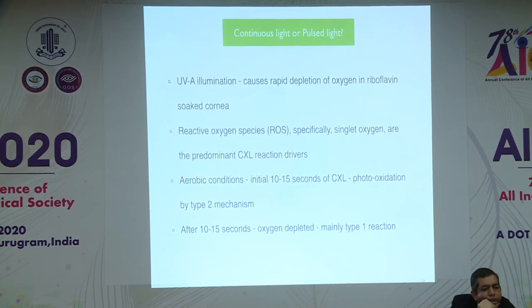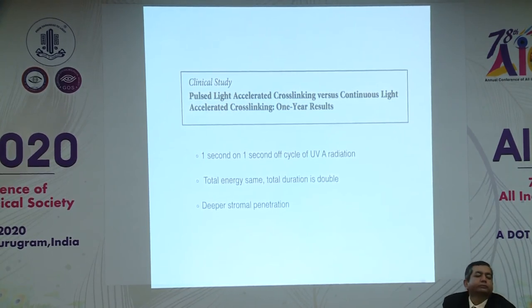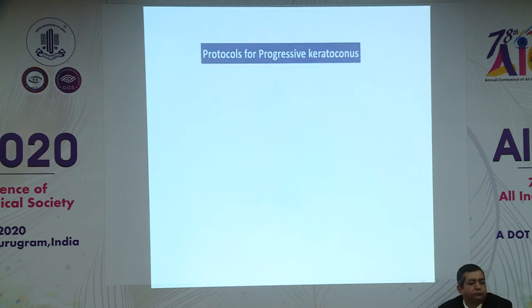So this question comes because UV illumination has been shown to deplete the oxygen in the riboflavin-soaked cornea, which is very important for photooxidation, that is type 2 reaction, to occur. But in pulsed protocol, we have 1 second on and 1 second off cycle. The total energy remains the same, but the total duration is double. And this is one study which showed that there was deeper stromal penetration as well of the riboflavin, but the functional outcome was same as the continuous therapy.